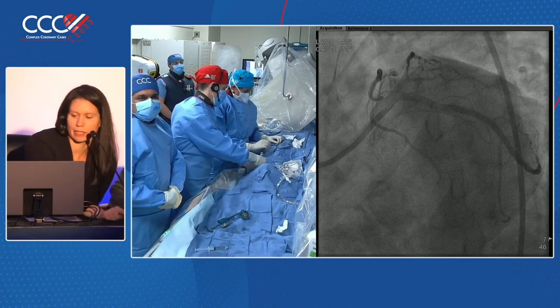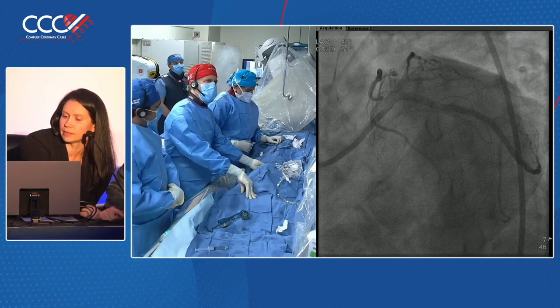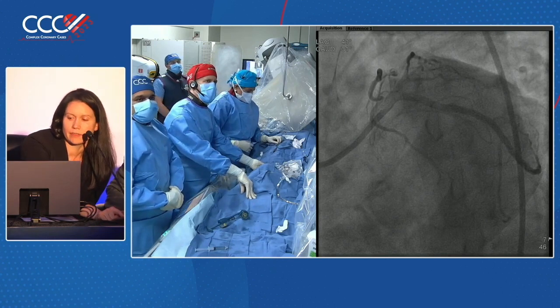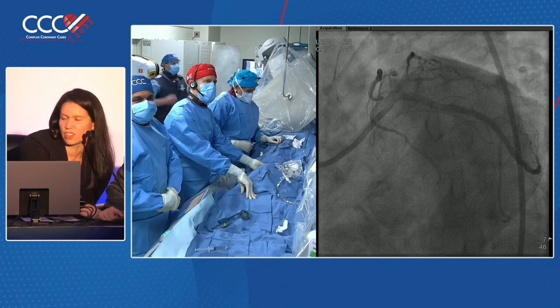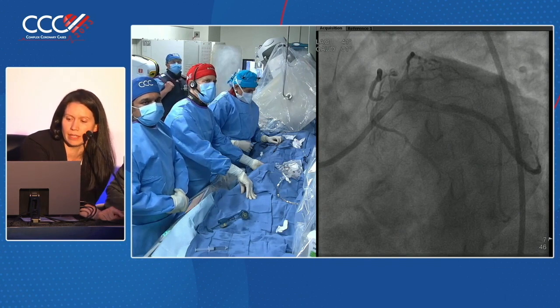Where do we start, imaging and all that? Is it IVUS, is it OCT, is it FFR? How would you go? I have a slight preference for IVUS in bifurcation cases just for contrast utilization, but in particular, because there's a couple of things that we might need to check.